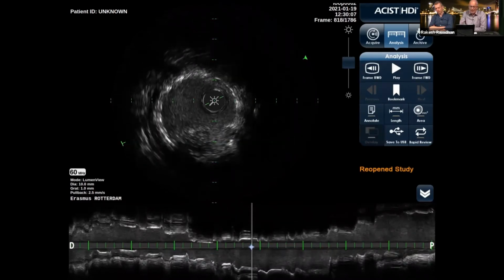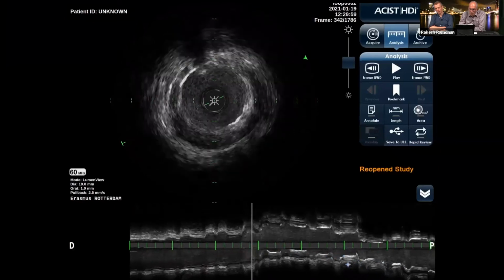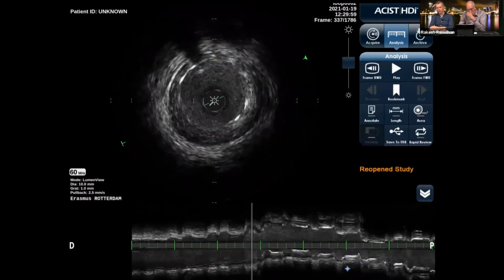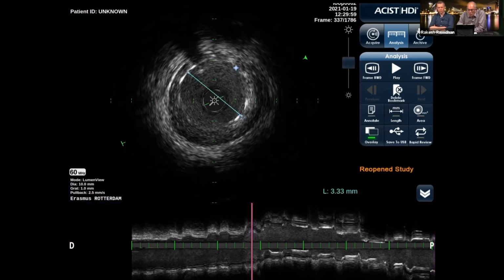So this is a nice demonstration on how you could use the imaging to look actually at what you did. So this is a 4-0 stent, and if you look at the distal edge, you can see that this actually is a stent that did not manage to reach the 4-0 criterion. Maybe if you draw a short line length measurement, you can demonstrate that. And this is when you just land in the plaque, because this is what happened. The stent ends just at the distal part of the plaque. You can see that there is some 20 to 30% underexpansion based on the manufacturer's expansion areas.